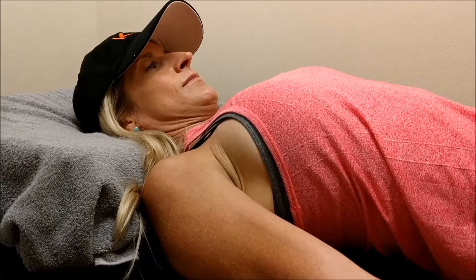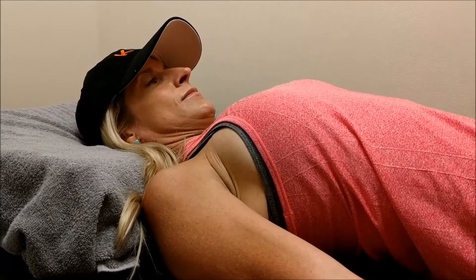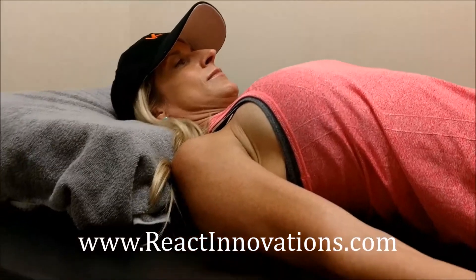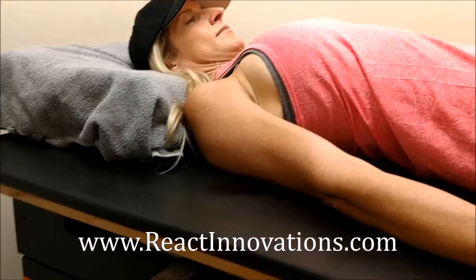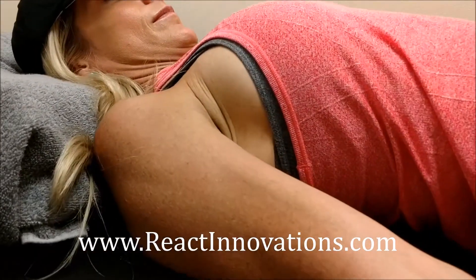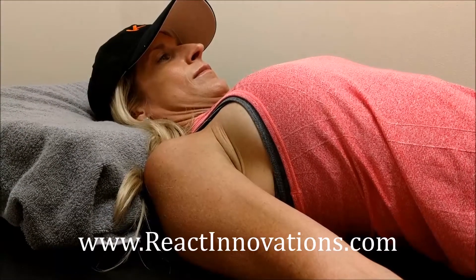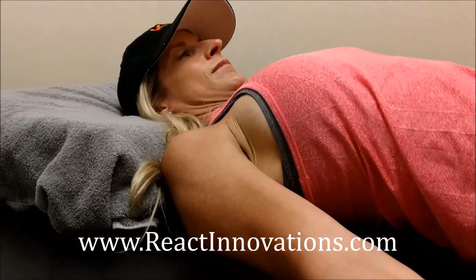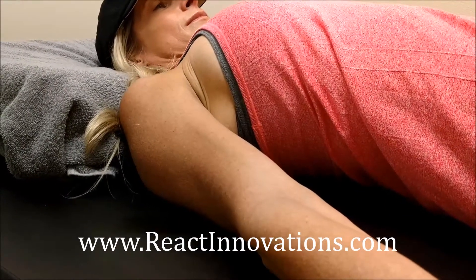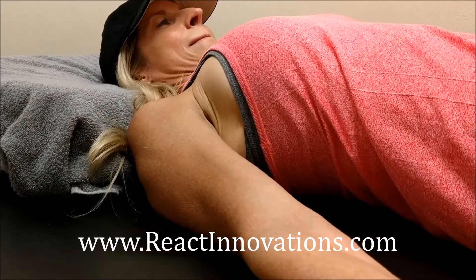Here we are treating the back and shoulder regions. The patient is fully clothed and we're manipulating her upper back region. As we pull the wand back, you'll see that we're able to easily move into the shoulder region, conditioning that muscle and warming it up as well as building strength. As we manipulate the frequency, the rapid nature of the magnet increases and we're treating more of the peripheral nerves in that region.